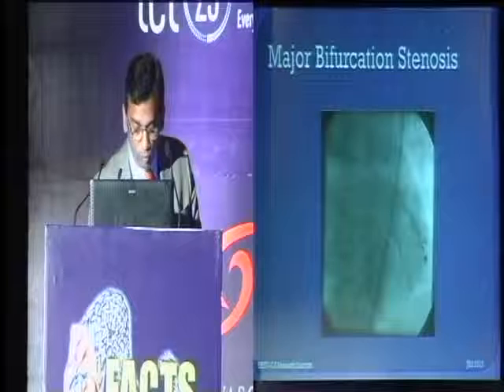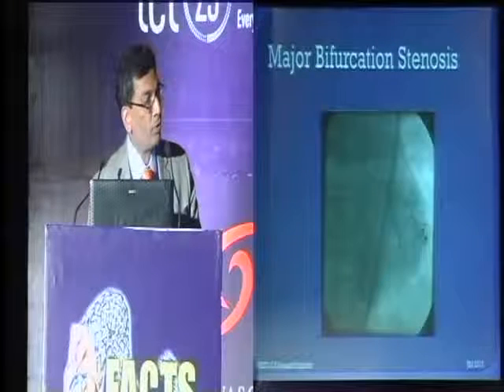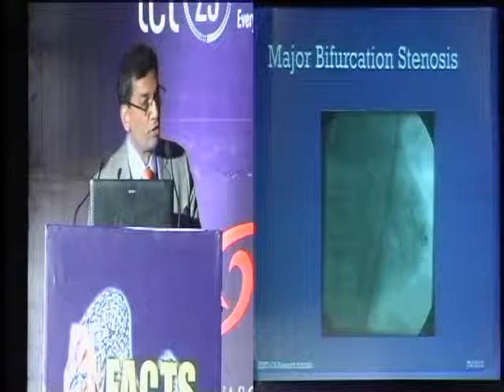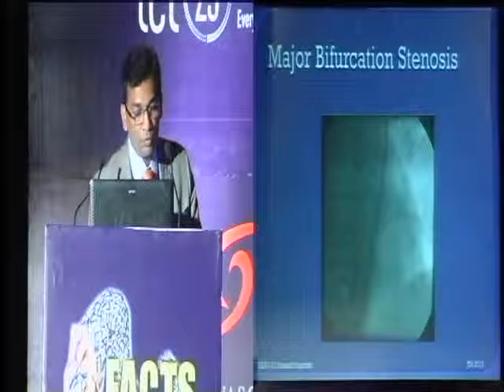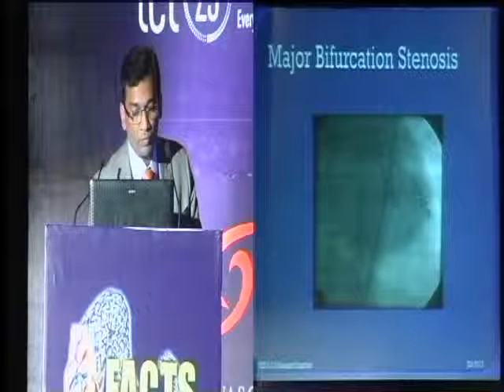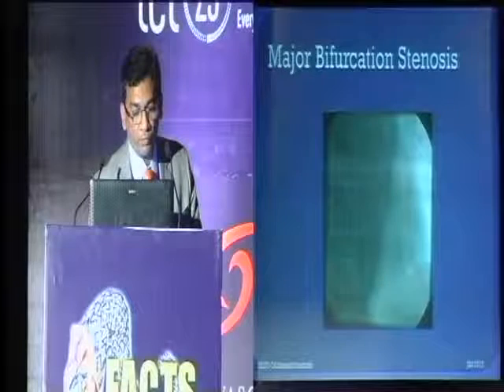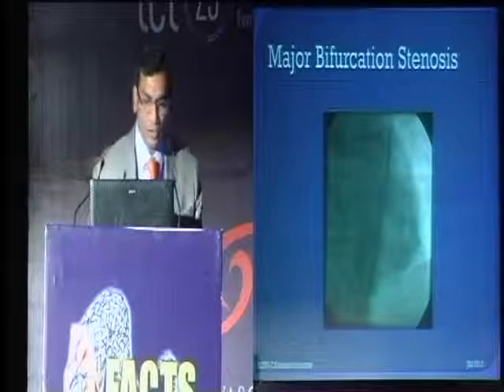And then we did more atherectomy, which I was again mentioning about. Optimal atherectomy is the key for successful long-term restenosis prevention. Did a kissing balloon. I can't see well if this is.